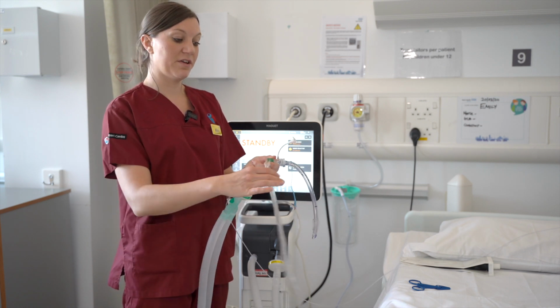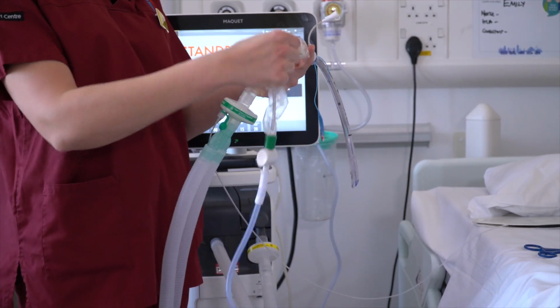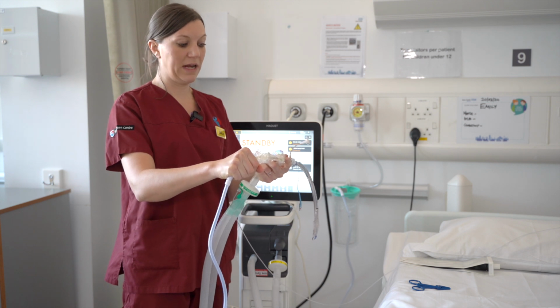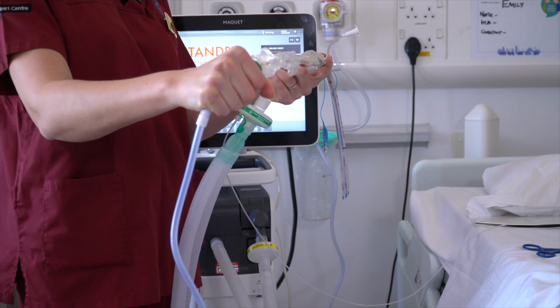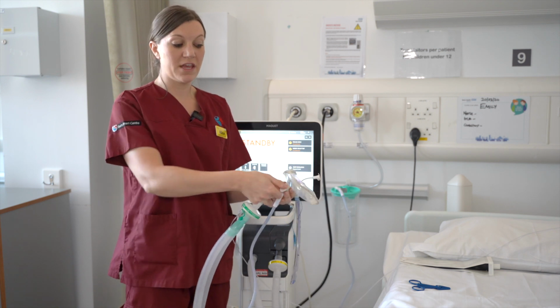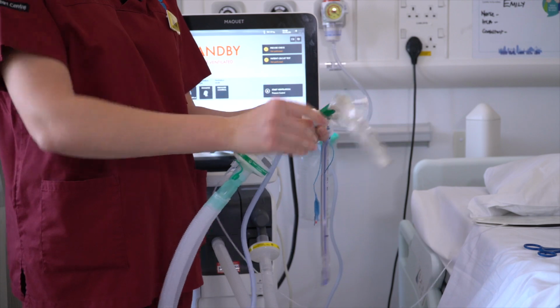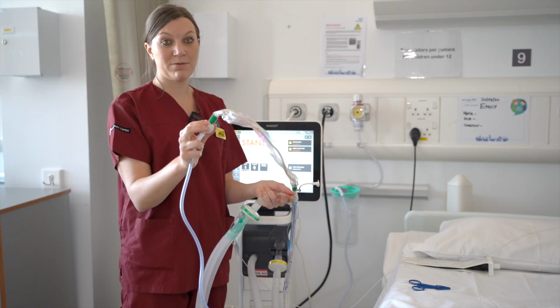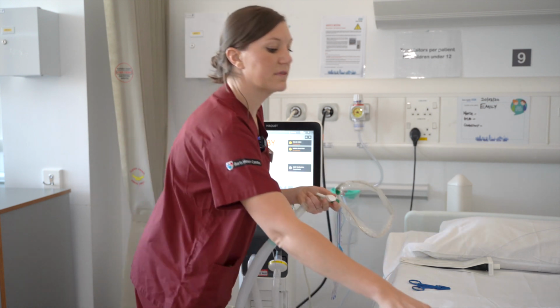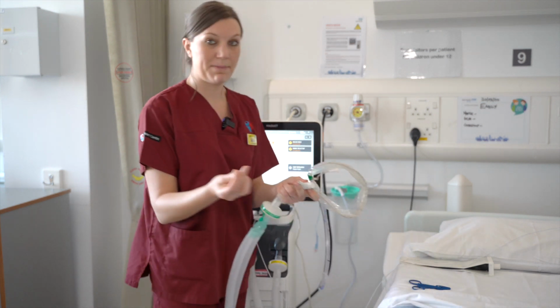From here, you can insert the suction catheter into the endotracheal tube, apply your suction and pull out gently. You must then make sure that you lift and twist the cap again so it's no longer able to be depressed. Remove the suction and reapply your cap.